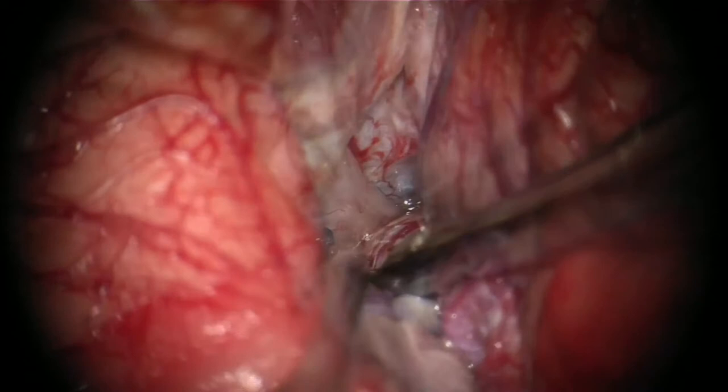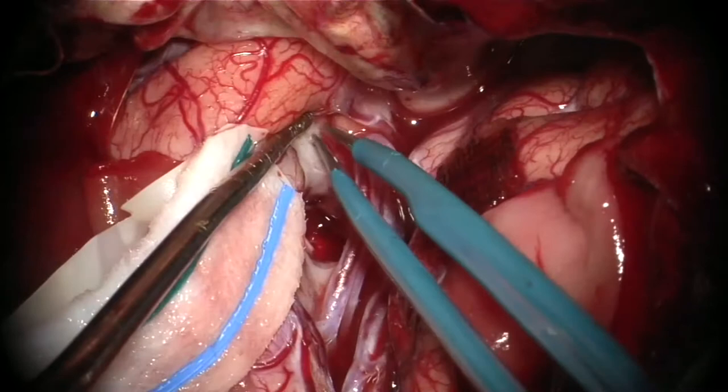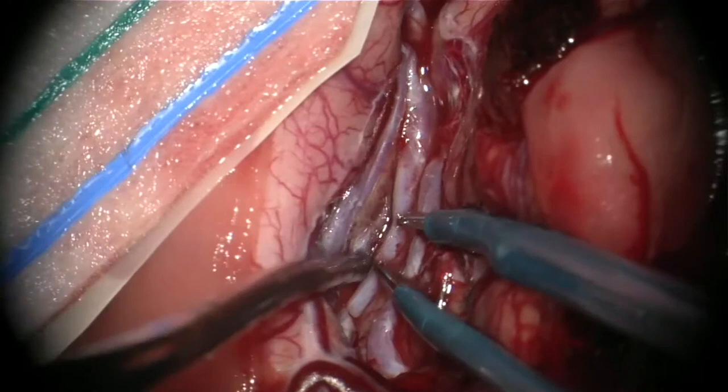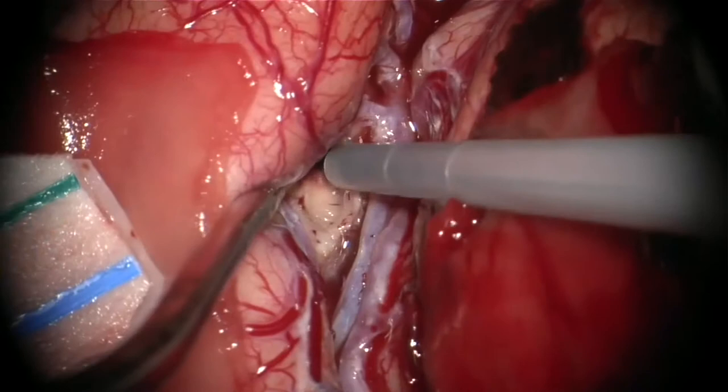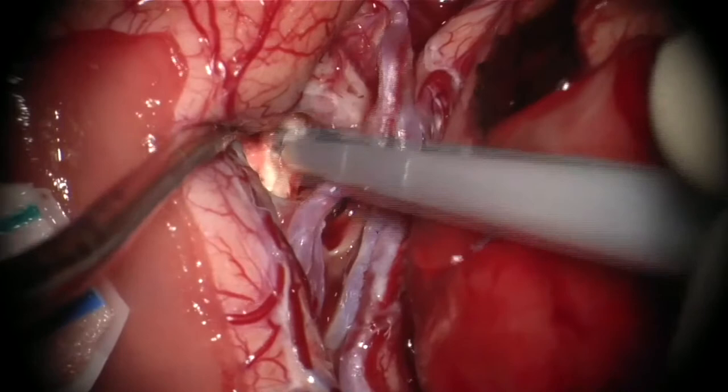Now I can identify the oculomotor nerve and I dissect the arachnoid from the uncus. And I can now coagulate all the surface of the uncus. I now continue my access to the inferior insular sulcus. Now I'm working in between the MCA branches. And now with the ultrasonic aspirator, I can start working my way through the white matter to get into the tumor. I can work on each side of these MCA branches and anteriorly towards the uncus.